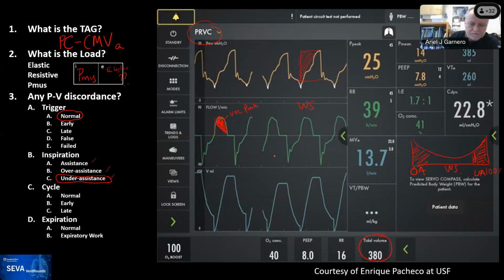Are you talking about the cycling part? The inspiratory part, when the flow goes to 0. So how do we know the pressure until where work shifting is produced? Because you mark up to PIP, but it seems that the flow... What's PAP? I'm sorry, Ariel, I don't understand PAP. Can you explain what you mean?